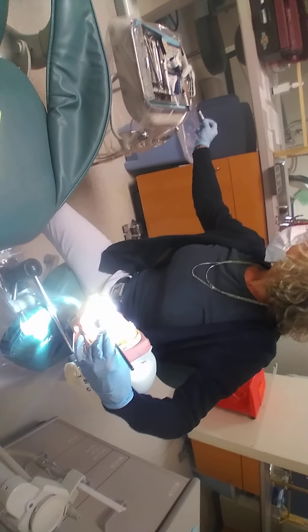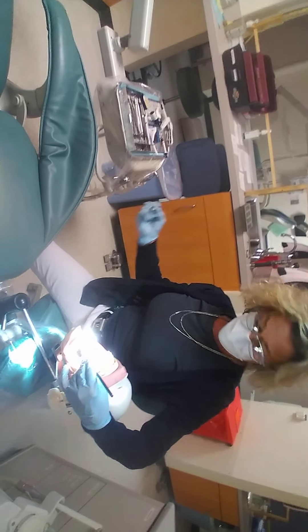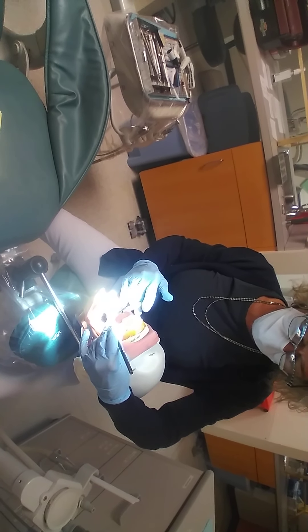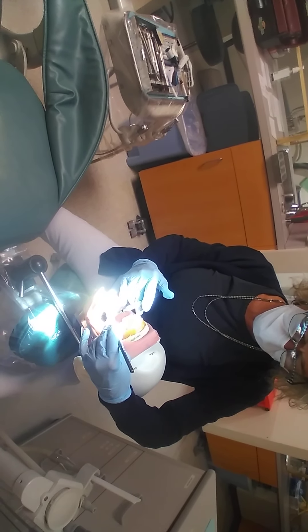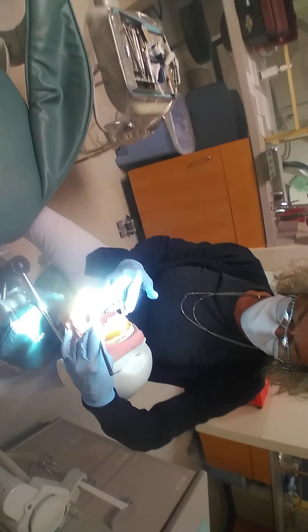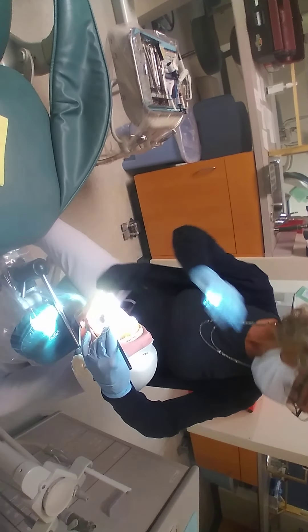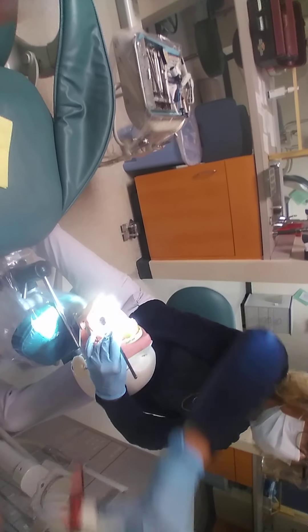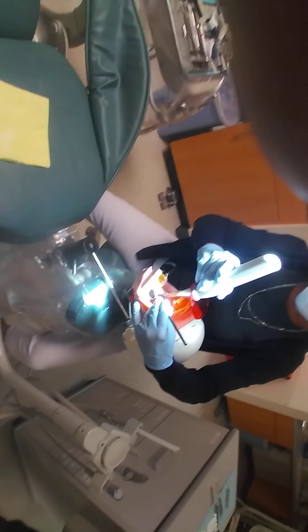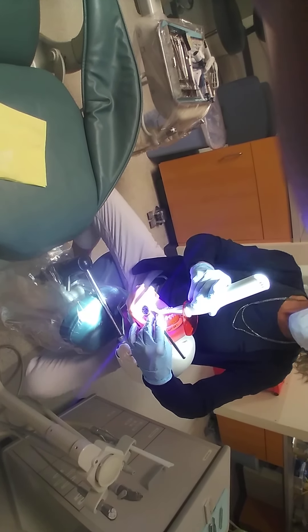Now I can take my composite and put 2 millimeters of flowable composite onto the pulpal floor and axial walls. That's going to flow into all those dentin tubules that were filled with resin, which is going to increase the retention of my restoration. Because this composite has fillers in it, I need to increase my curing time to 20 seconds.